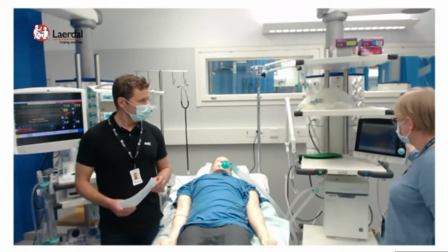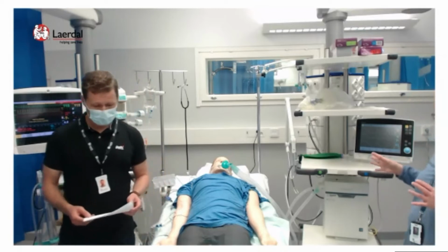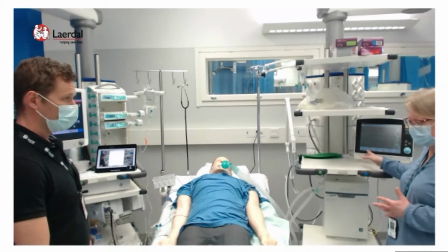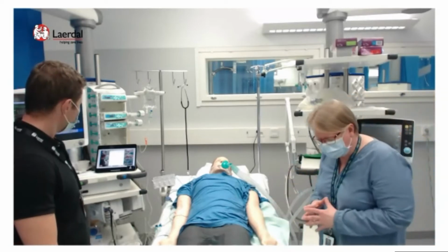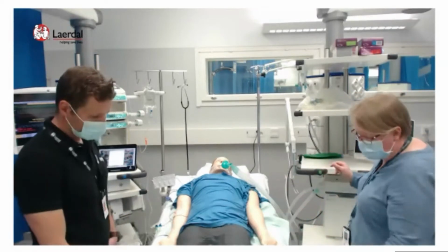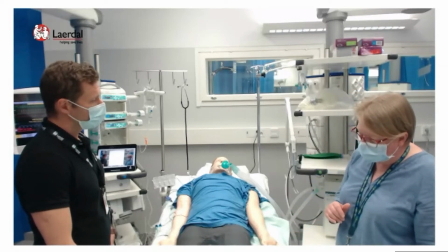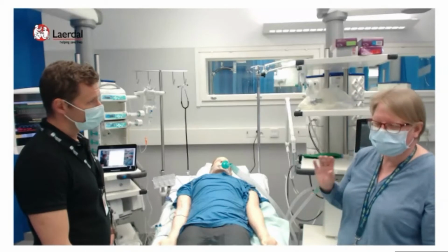He's intubated and he's on the volume control synchronized mandatory ventilation. I don't know, is this very well seen? Because the mannequin is an electrical equipment, we are not able to put the FiO2 as we like, so it goes to 21%. And also the PEEP is a little bit lower than it should be. In the beginning, this patient has tidal volume of 510 milliliters. The frequency is 20 per minute, and end expiratory pressure is 8 centimeters water, and the fraction of inspired oxygen, FiO2, is 0.5, it's 50%.